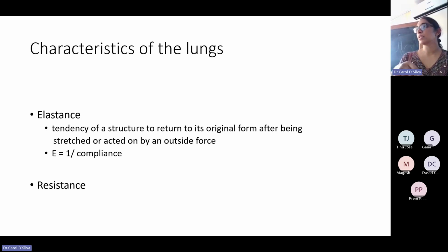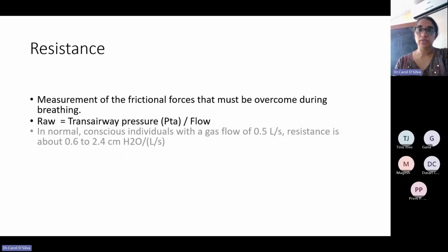And these are inherent properties of the lungs. So this is where the problem arises. This is what gives rise to all your pathophysiology. You can play around with tidal volume, you can set rate, FiO2. But what is very difficult to change, because these are inherent properties of the patient's lungs, are the resistance and elastance. So this is why you have medicines like bronchodilators, and then we prone the patients, and we diurese the patients. You're basically trying to improve the resistance and compliance. That's what you do as clinicians. So we'll just go through each of these.